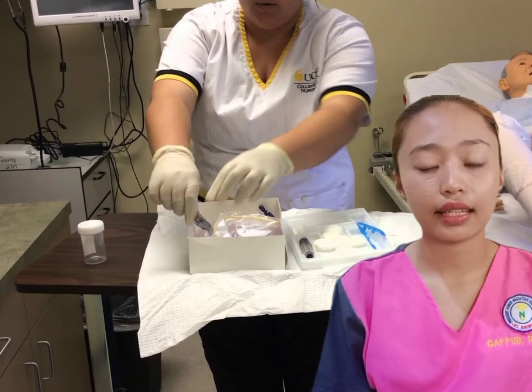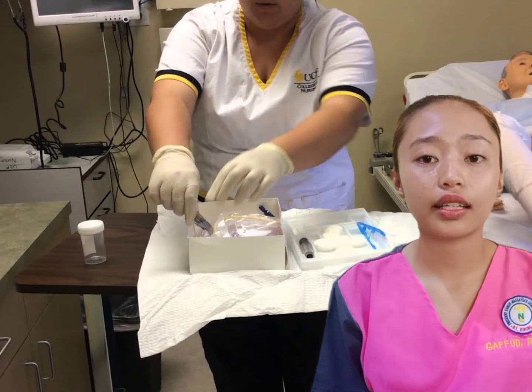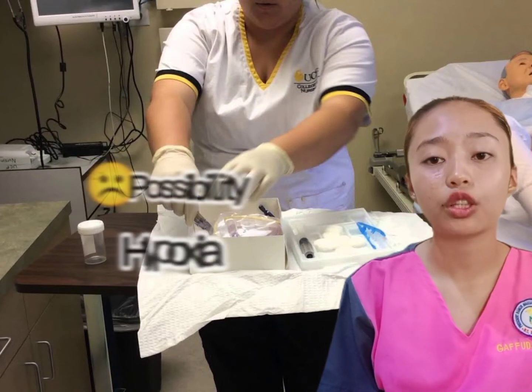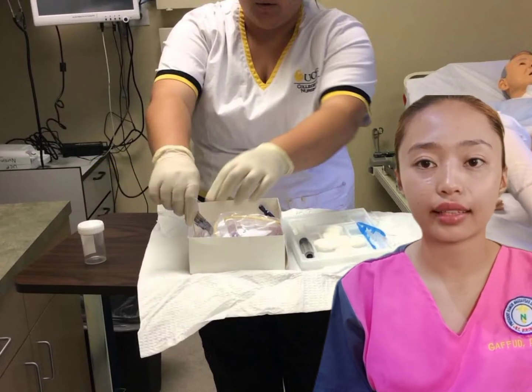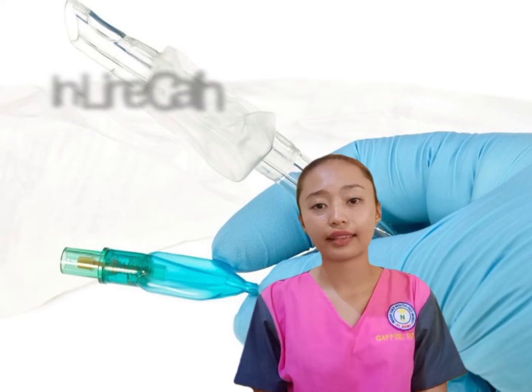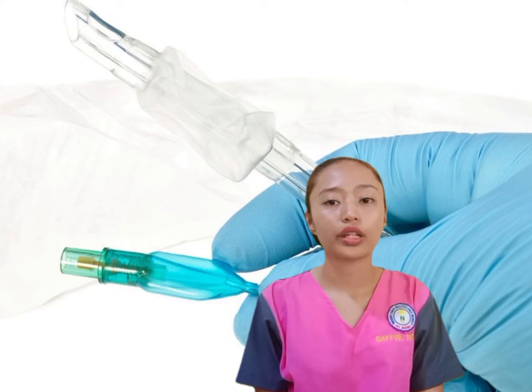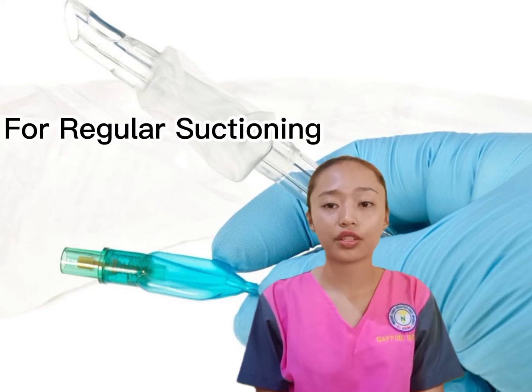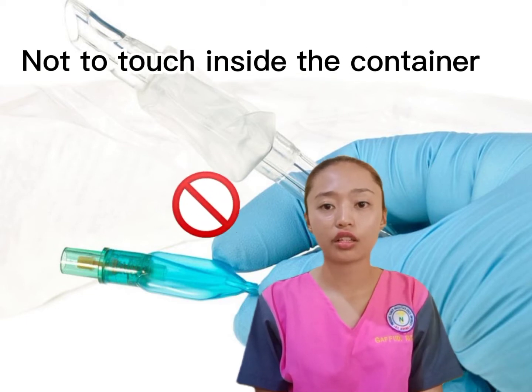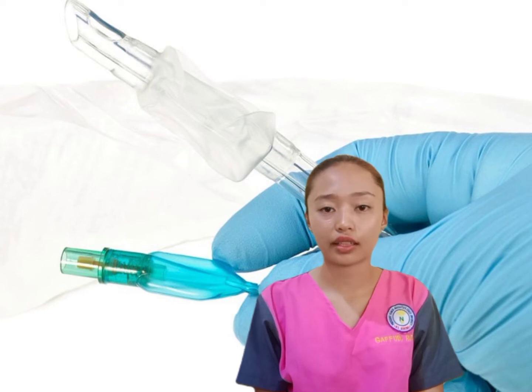Catheter size should not exceed 1/2 the inner diameter of the airway. A catheter exceeding 1/2 the diameter increases the possibility of suction-induced hypoxia and atelectasis. Prepare the catheter flush solution. With an inline catheter, use sterile saline bullets to flush the catheter. With regular suctioning, set up a sterile solution container, being careful not to touch the inside of the container, filled with sterile saline or water to flush the catheter.